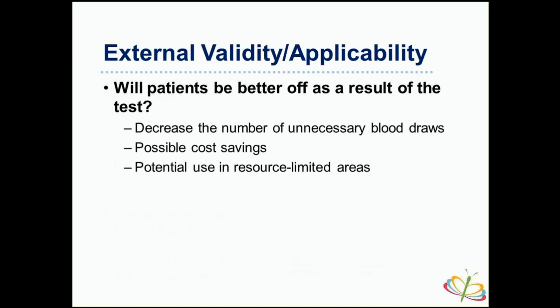This is the reality of a lot of resource-limited, resource-poor areas. So theoretically you have a smartphone and can access data in some way, shape, or form, and not have to buy an expensive machine that would require upkeep.